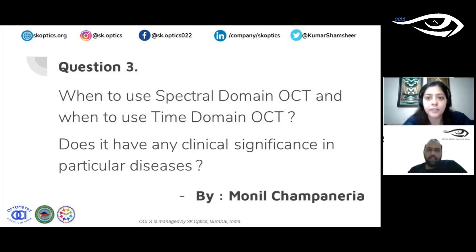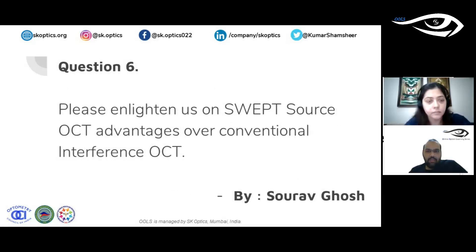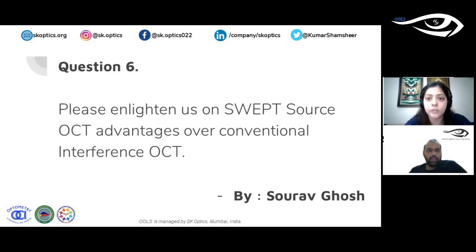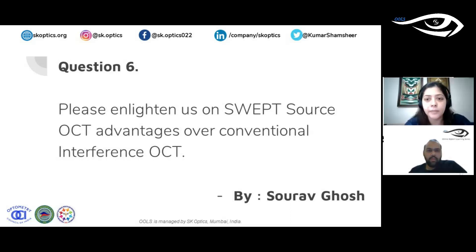Regarding swept source OCT advantages: it provides better imaging of deeper layers including choroid and sclera due to longer wavelengths. However, not everyone has access to swept source OCT. The key point is to get the best from whatever machine you have. Normal spectral domain OCT with enhanced depth imaging (EDI) is excellent for most clinical imaging needs.